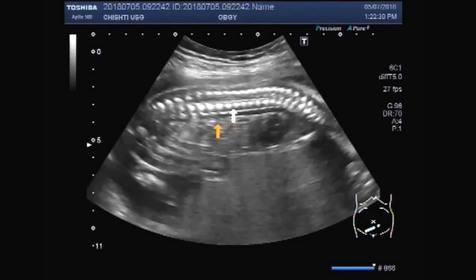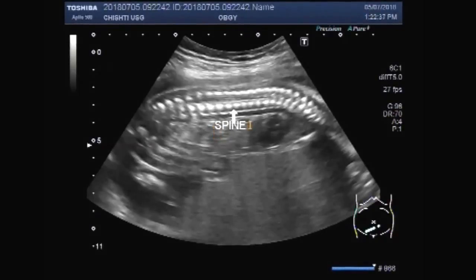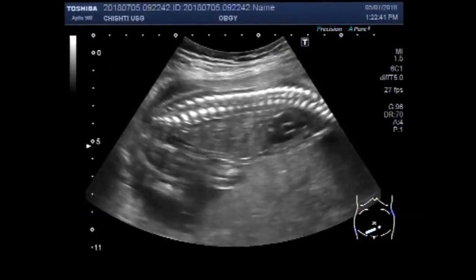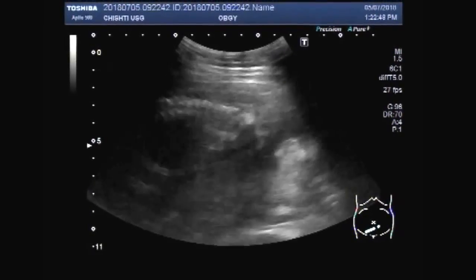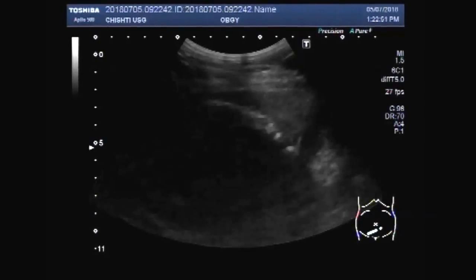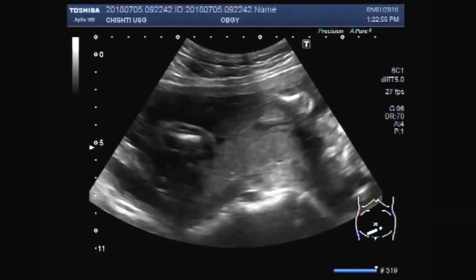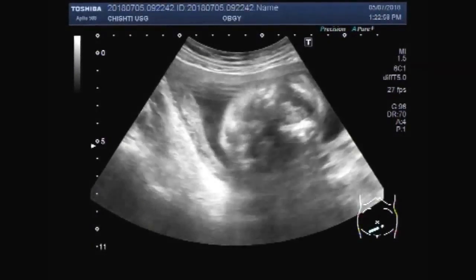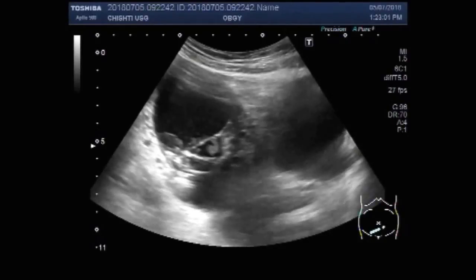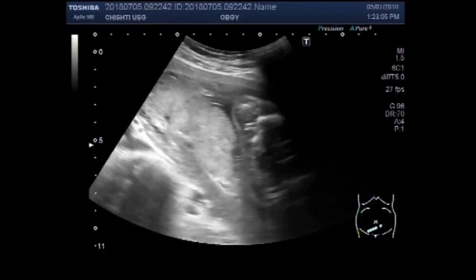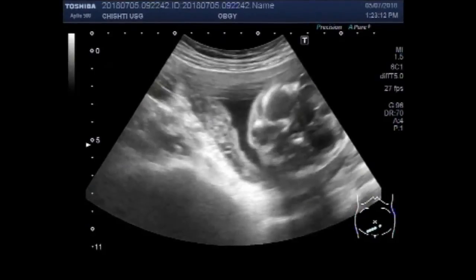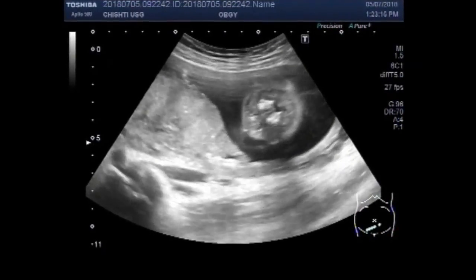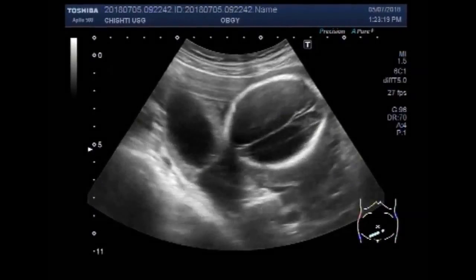These are the fetal spines. You can see the fetal abdominal cavity. Now you can see the placenta lying left lateral, and the fetal head.